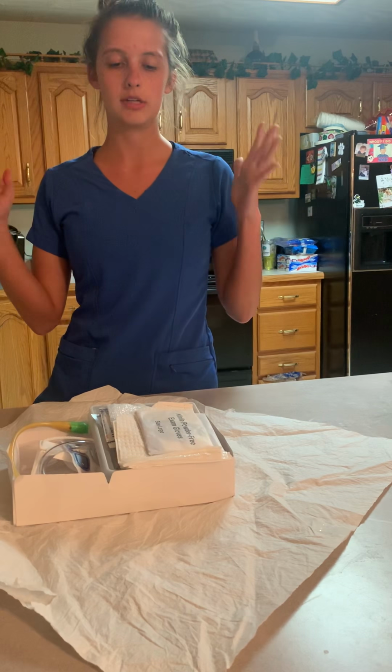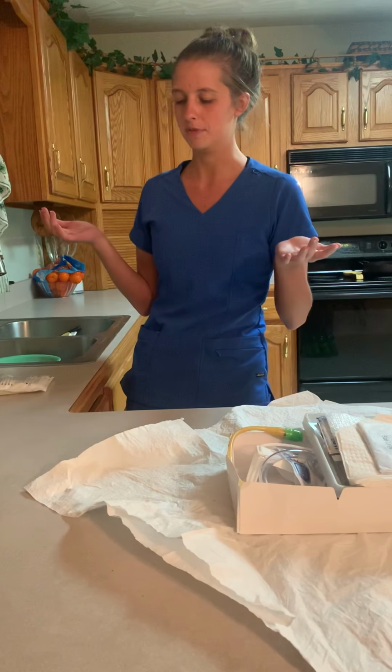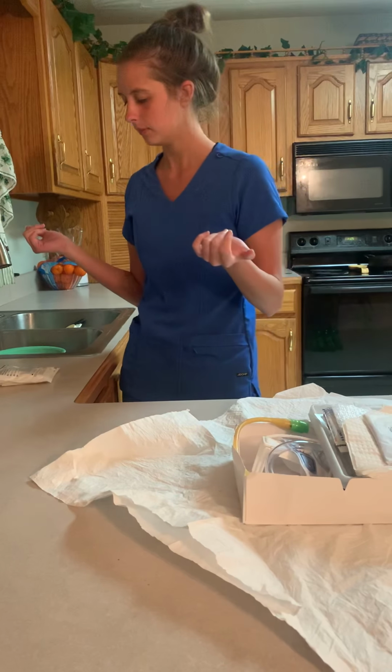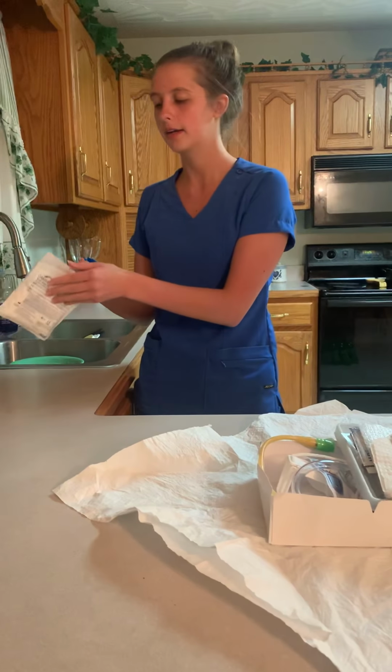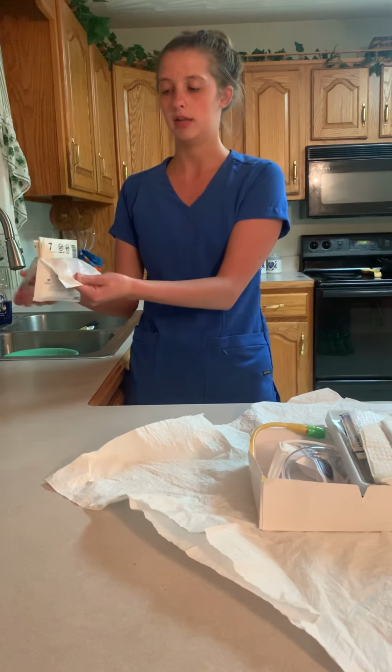Okay, now that we have our sterile field open, we are now going to put on our sterile gloves, but while doing this, we're going to keep our sterile field in the line of my vision. So I'm going to step over here and keep the sterile field in my line of vision. I'm also going to make sure that when I put the sterile gloves on, it is done above my waist. So we're going to go ahead and open up my sterile gloves, again keeping the sterile field in my line of vision.